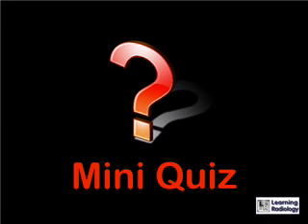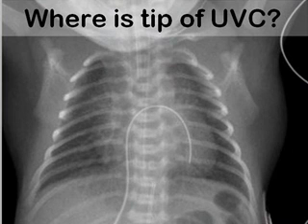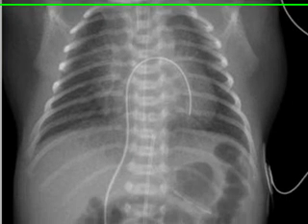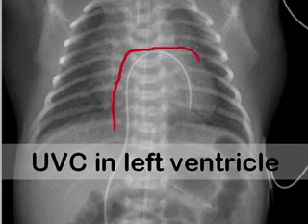It's time for the mini quiz — get ready to pause your computer or MP3 player. Where is the tip of this umbilical venous catheter? The catheter extends up the vena cava into the right atrium, across the interatrial septum into the left atrium, and then winds up in the left ventricle.